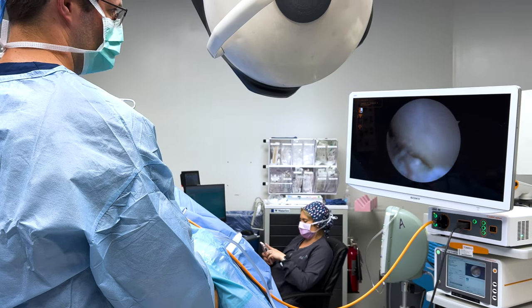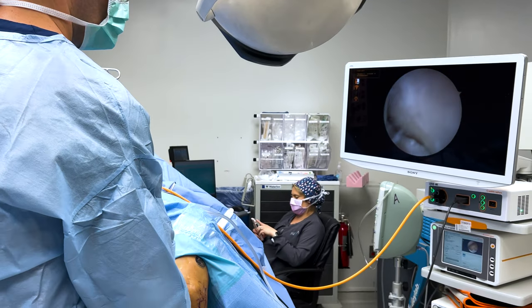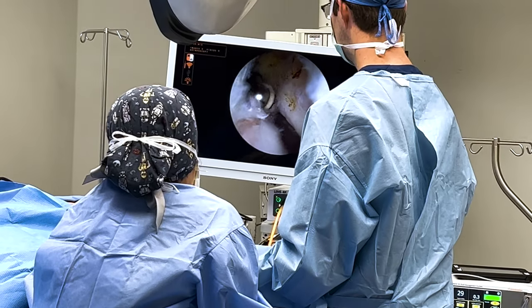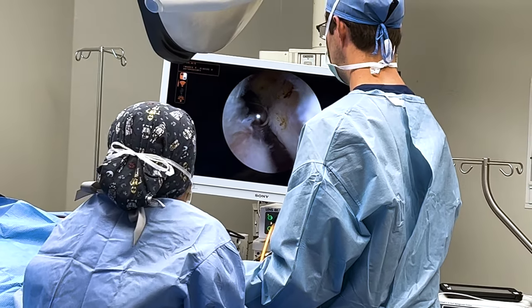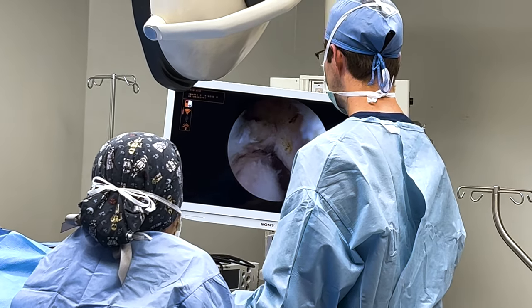I am looking at the joint on the screen. Once we see where the problem is, we will use instruments to clean up any arthritis or inflammation. And for a tennis elbow procedure, we will look at the tendon that is causing the pain and remove the painful degenerative tendon from the inside out.